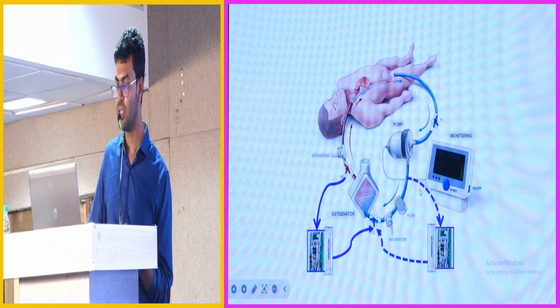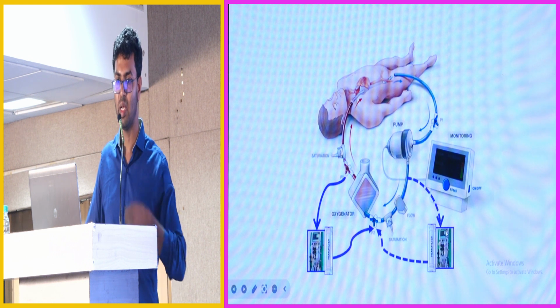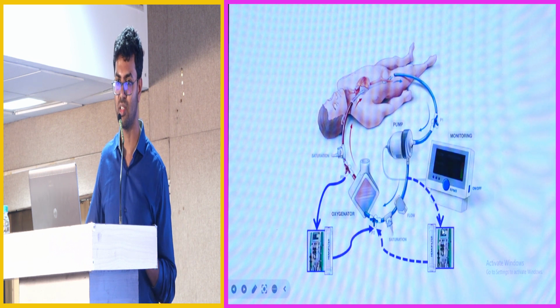The other example is that take both of them in the post membrane, post pump, but always returning cannula in the pre-membrane. Okay, don't put your access from here, because there will be a lot of negative pressure, minus 100, and your roller pumps may not be able to pump that blood into the CRRT circuit at those pressures.